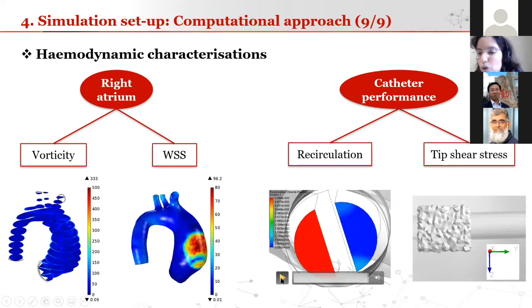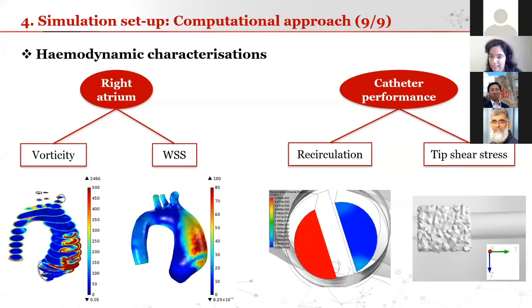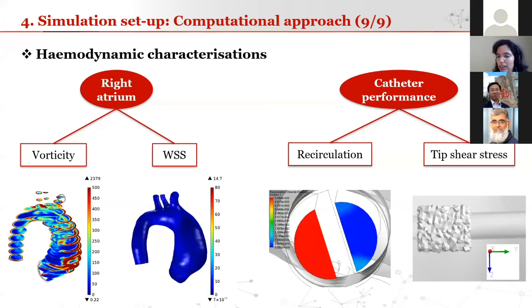And then we also quantified the shear stress at a volume created at the tip. And that volume is represented here by this block. So for all catheter models, we created these blocks to get that quantification of the shear stress.